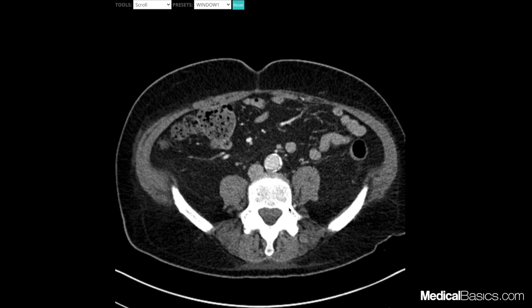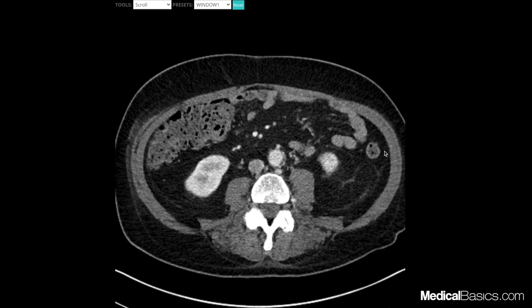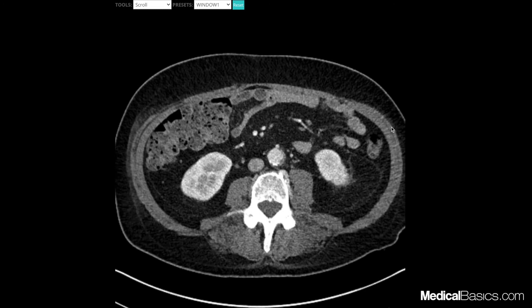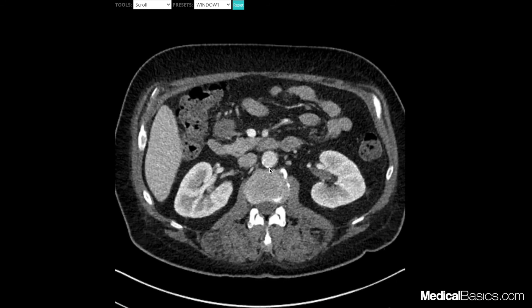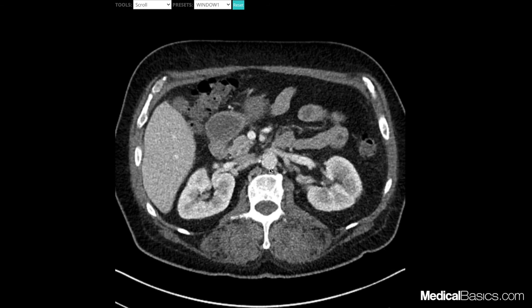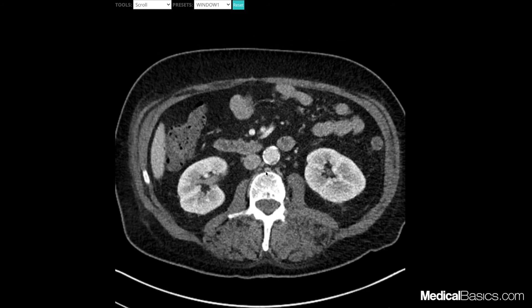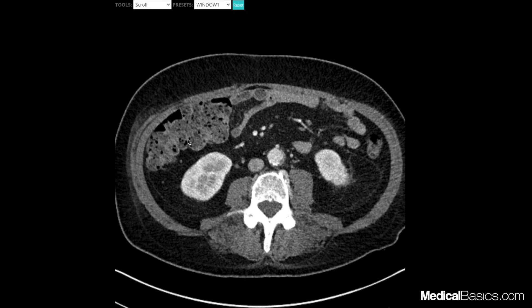There are also lymph nodes all along the mesentery and the omentum. When you have a patient who has colon cancer, you want to look very carefully all around the colon for lymph nodes, because it's quite abnormal to have large lymph nodes around the colon or rectum. You may have retroperitoneal lymph nodes a bit more commonly, but you typically don't have them around the bowel unless there's some abnormality — it can be reactive or metastatic spread. So whenever a patient has a known colon cancer and you want to figure out if it has spread, you need to look at where these lymph nodes drain.